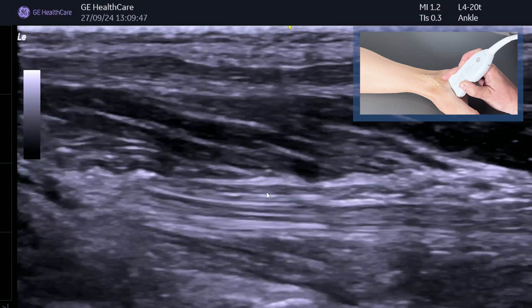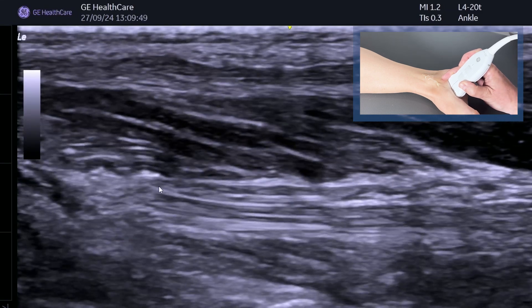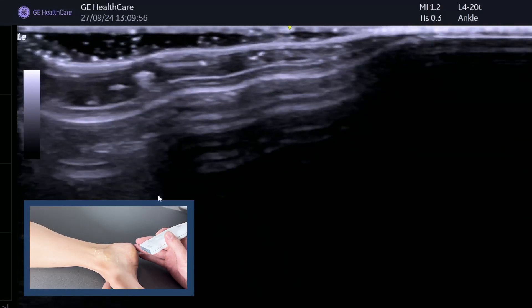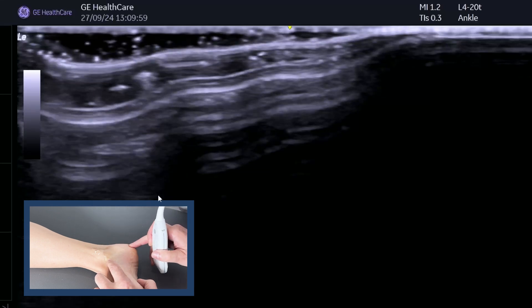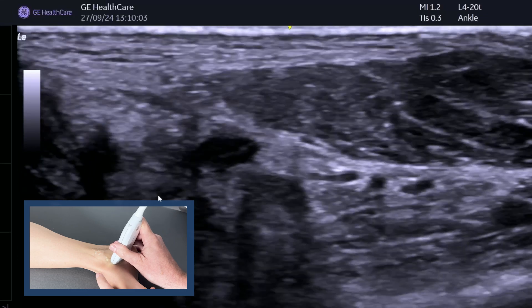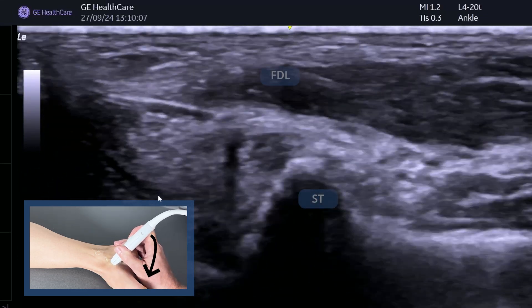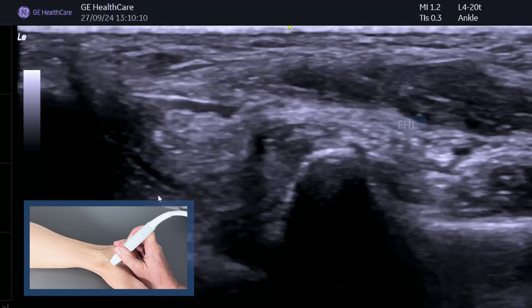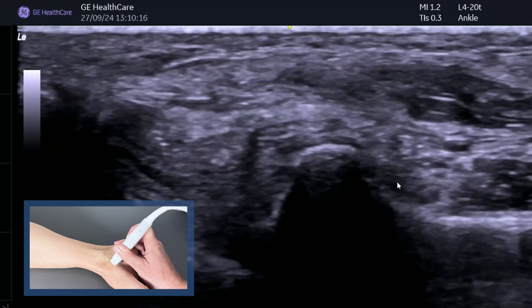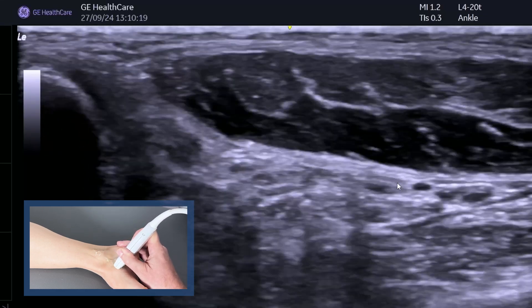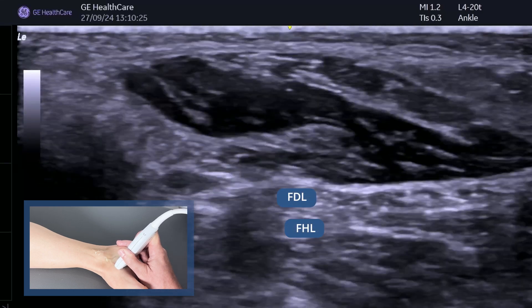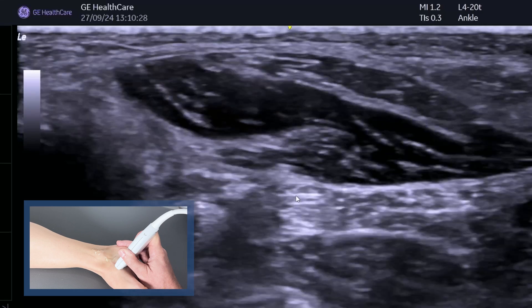FHL on top, you can see FDL — and this is where they're overlapping. Now, a slight quicker way of looking for it: if you just pop one finger on the navicular, one finger on the back of the heel, and place the probe across that in transverse and tilt the probe, then you can normally pick up FDL. If you then wiggle the big toe, you can see the FHL tendon underneath the sustentaculum tali. Then you just follow it down towards the big toe until you get that coffee bean, where you've got FHL underneath and FDL. You can then spin into long and use your FHL to identify it.